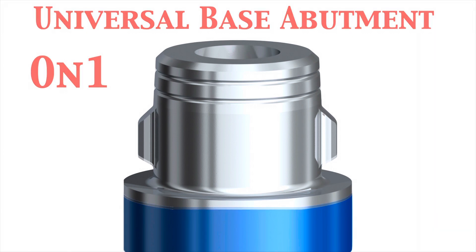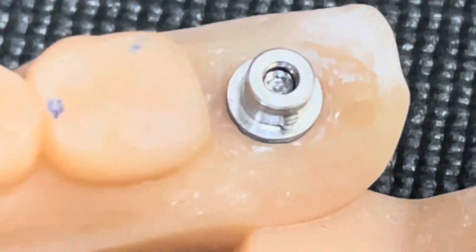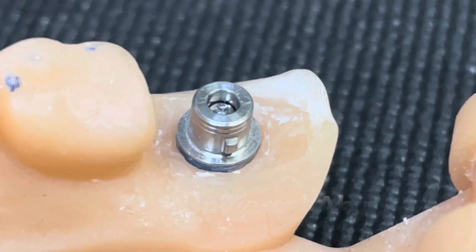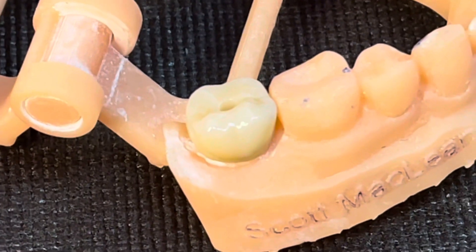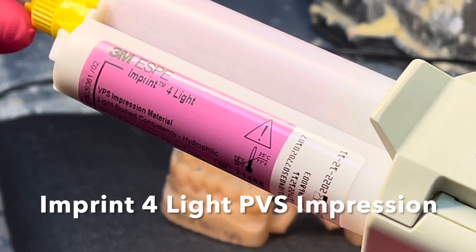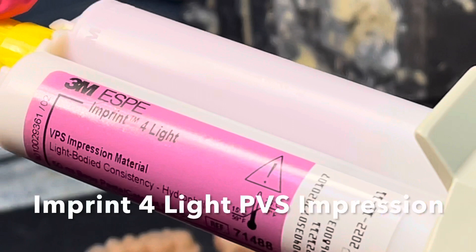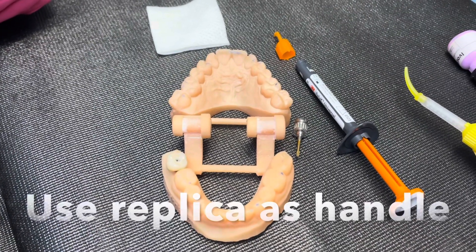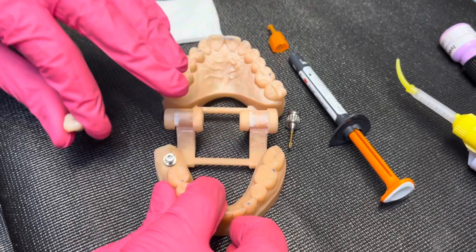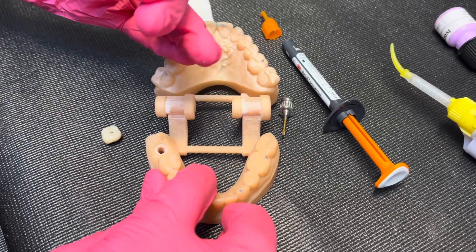Zirconia is my favorite here because it's so strong. It makes a very thick piece of zirconia supported by a titanium shoulder, which is extremely strong and very long-term for the implant. Our goal is to bond these two together. We'll use some Imprint 4 first to block out the channel so that restorative cement doesn't go into that area. We use the replica as a handle, because everything is very small and tiny during these steps.